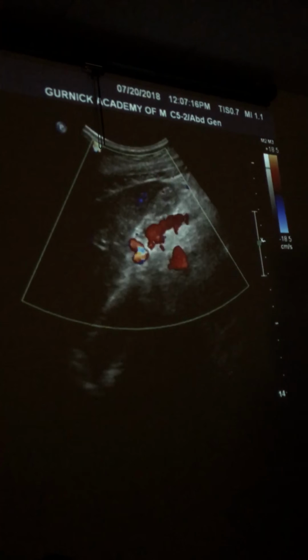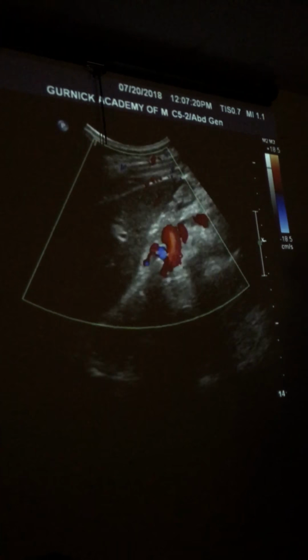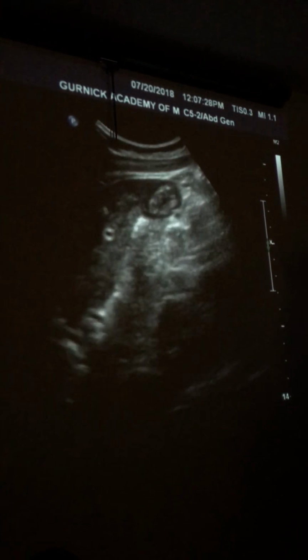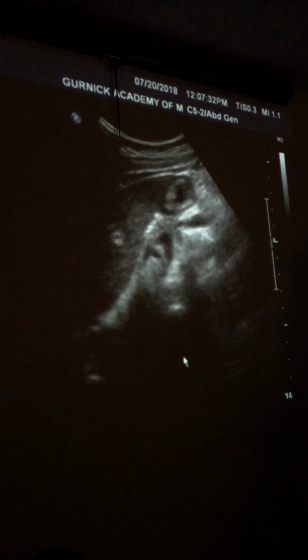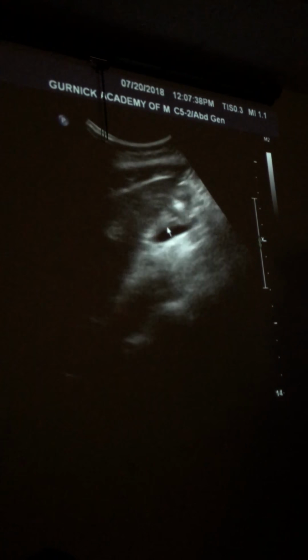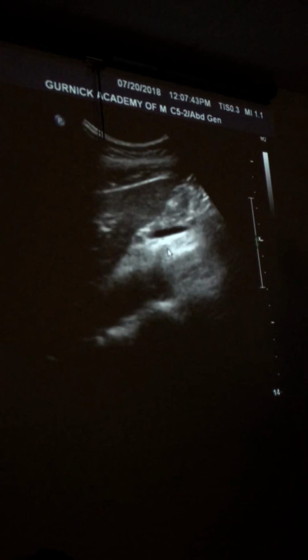Now I'm angling up, I'm heel toeing, I'm sweeping, and I'm using my color as a tool, not as a crutch, right? When you take color off, it's kind of a challenge in most people. Oh, not hers. Wow. Let's see a meet, okay? Here's her SMV. And here it is. Boom, right there. Look, it just joined. So, does that make sense, everybody? Is that a little helpful?